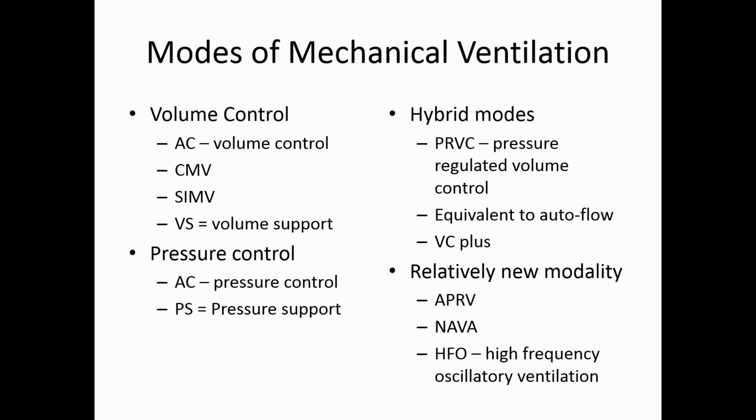So for us, it's autoflow, and the problem with that is respiratory therapy always puts people on autoflow. Supposedly, it's the most optimal for patients. But if the patient is agitated and working hard, the ventilator will sense the negative pressure the patient is generating and deliver less support.